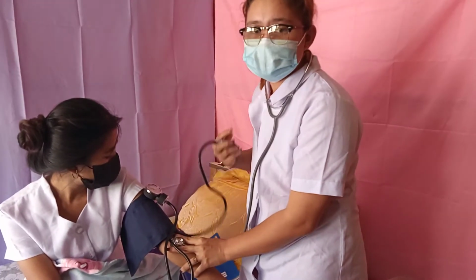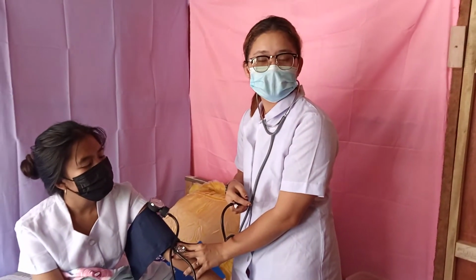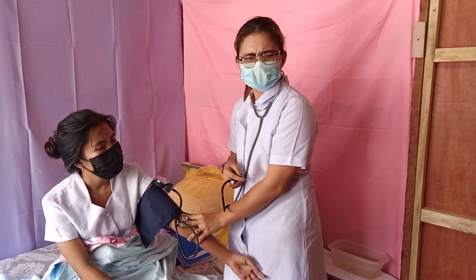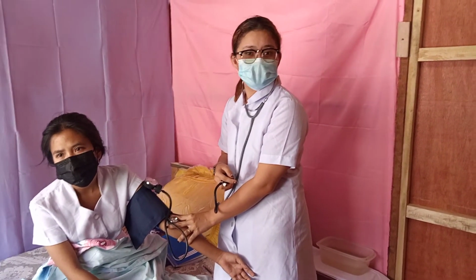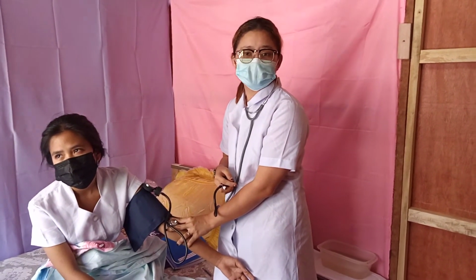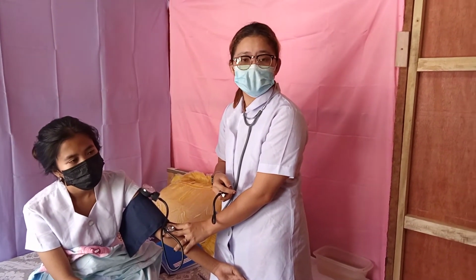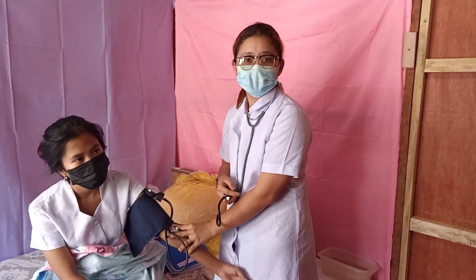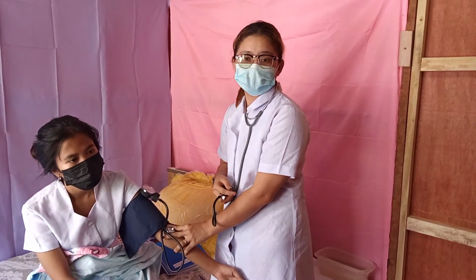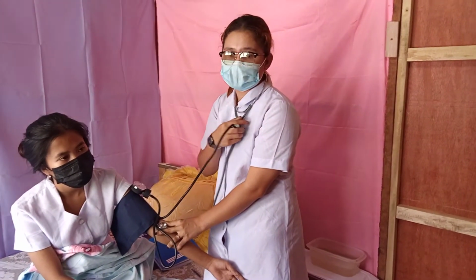After that, release the air in the valve slowly so that the pressure goes down at the rate of 3 mm Hg per second. If the air is released too slowly from the cuff, there will be a false reading, and if it is released too rapidly, sounds may not be heard at the accurate level.